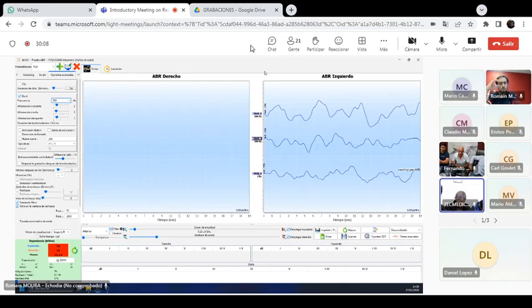There are different specifications about audiometry pointed out in the forms, but since we don't have the license, we cannot show it to the commission. We cannot show them how the osseous vibrator works. So that's the problem that we had. That's it.